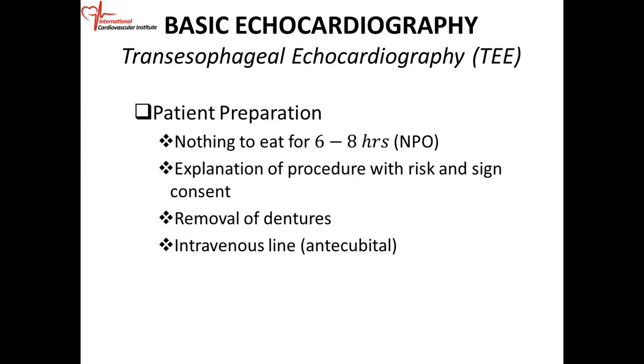You need to have a large IV in the patient's antecubital vein. Probably gauge 20 and above. If you can get an 18 gauge, that would probably be preferential. So you need to get an intravenous line in the antecubital vein.